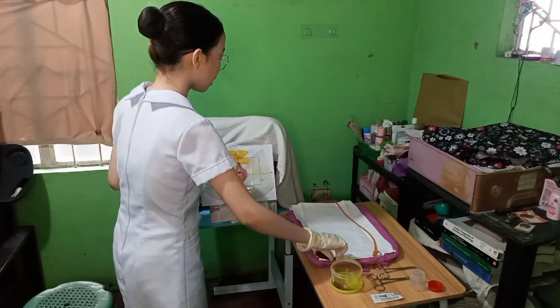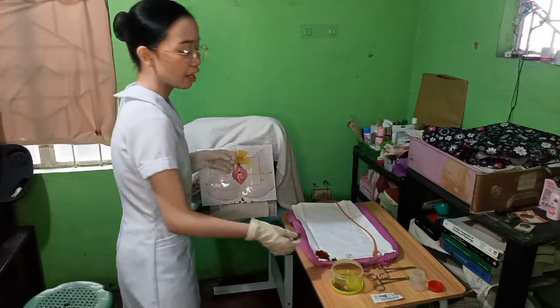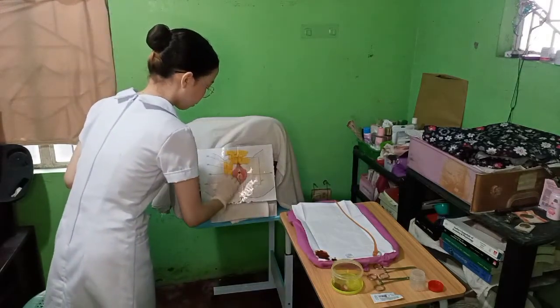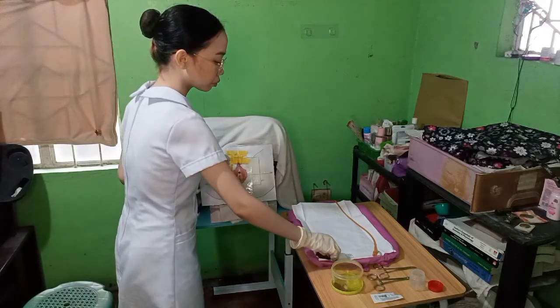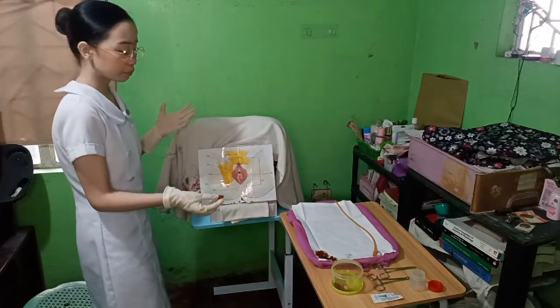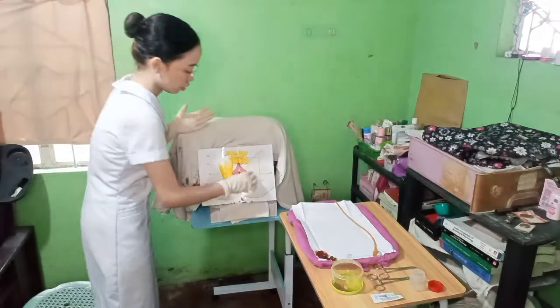So clean from the vagina outwards so that microorganisms will move away and not towards it. And then remember to use different cotton balls in cleaning the different sides.